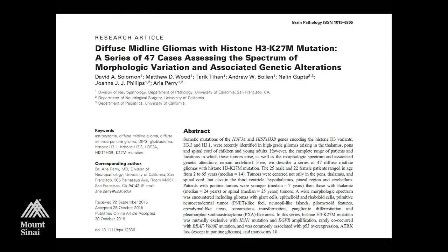Okay. So recently we did a little mini series of these with one of our fellows, David Solomon, who's now on faculty. They have quite a wide spectrum of morphologic appearances, and occasionally they may even look like pilocytic astrocytoma or ganglioglioma. I've seen a rare case that has perivascular pseudorosettes mimicking ependymoma. So just have a high index of suspicion for these.